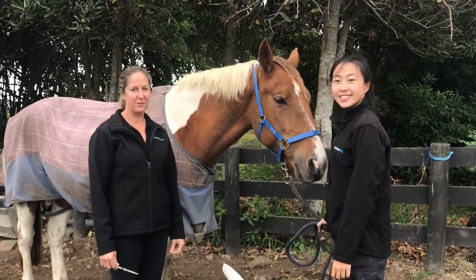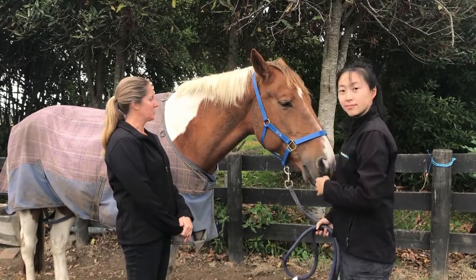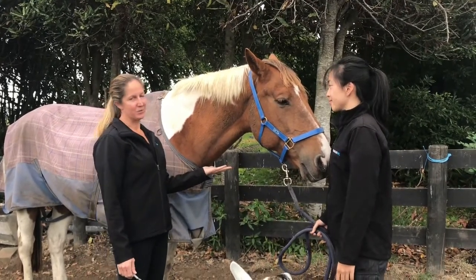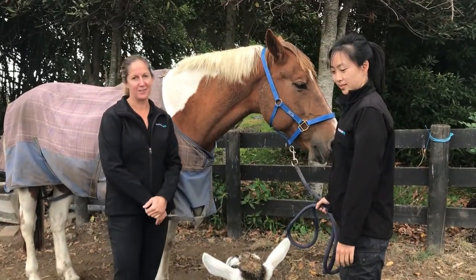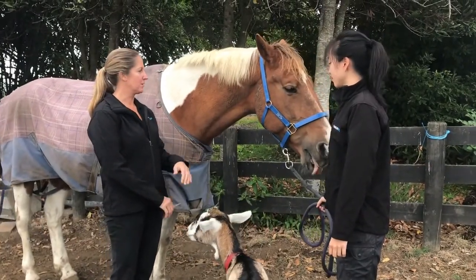Thanks for joining us today. We're going to go through how to give an intramuscular injection, also known as an IM injection. This is Melissa with Franklin Vets and her horse Lily. I'm Kendra, and we've got special guest Cookie as our observer. The most important thing is to avoid three major structures — they're what outline our landmarks.